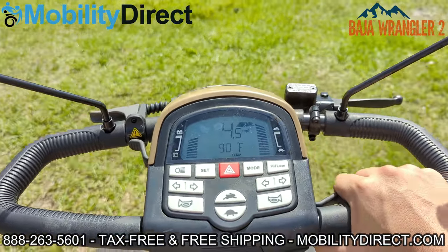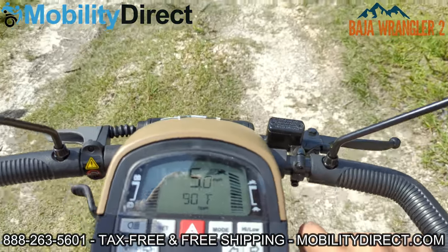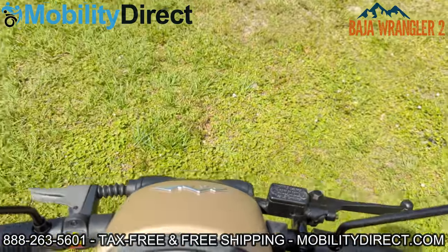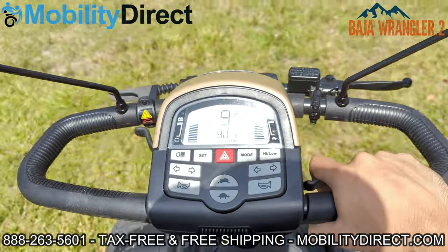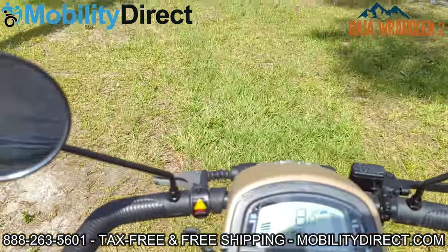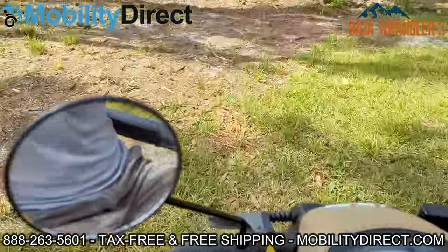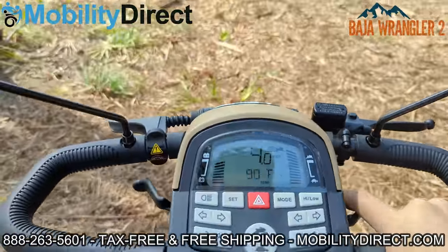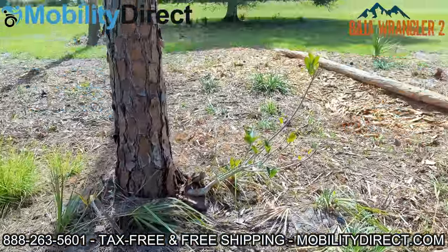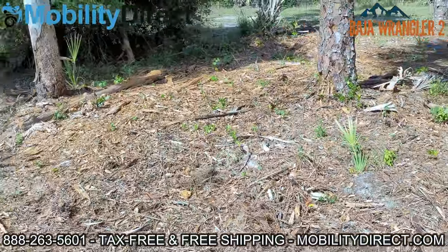We're going to go full send. Again, I'm Sergio with Mobility Direct — this is the Wrangler 2 by Pride Mobility, part of the Baja series. It's a new series that Pride Mobility is working on, and this is the first product released as part of the Baja series. We have a full page on our website for the Baja series where you can see all the products Pride is coming out with. I just want to show you the terrain in front of me — it is not by any means level.